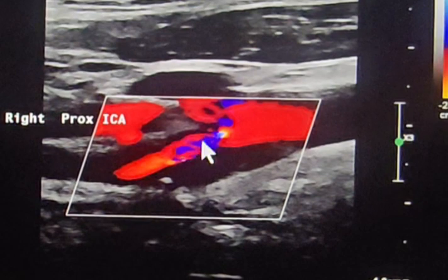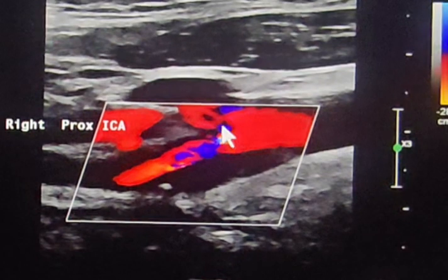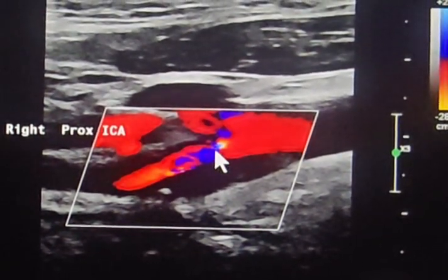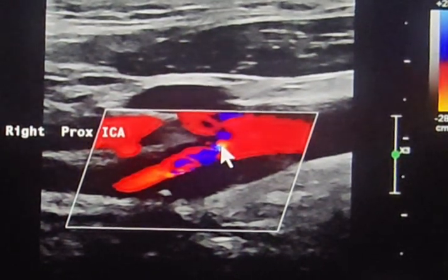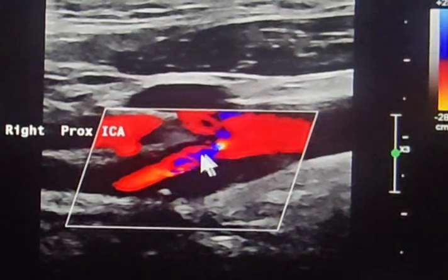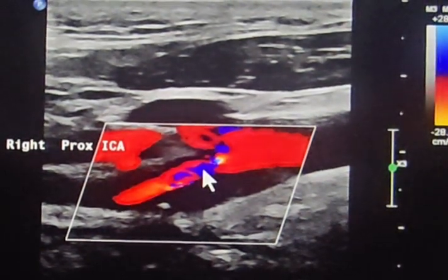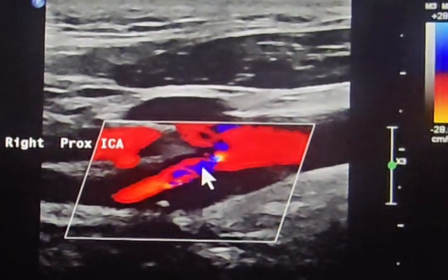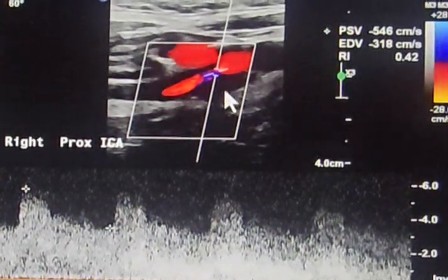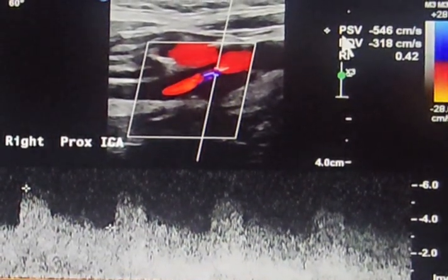We have to be accurate to calculate the degree of this stenosis. We use NASCET criteria, so we compare velocities — specifically we look for the maximum velocity. We put our cursor at the most narrow area, which is where we have the aliasing, and compare this velocity to the velocity at the common carotid artery to calculate the ratio.